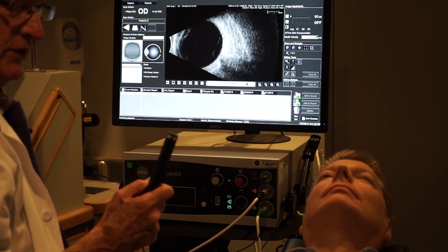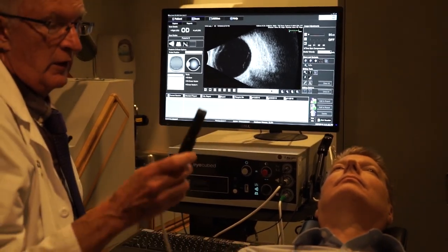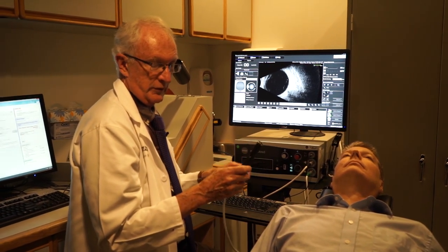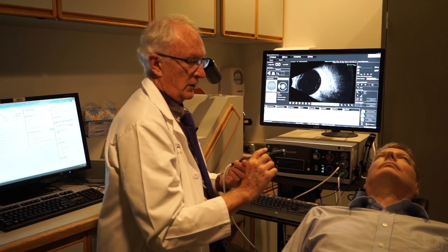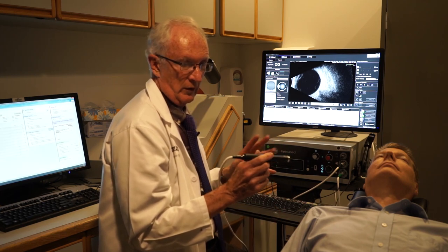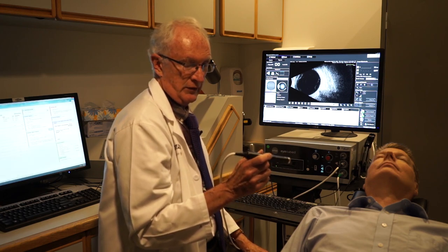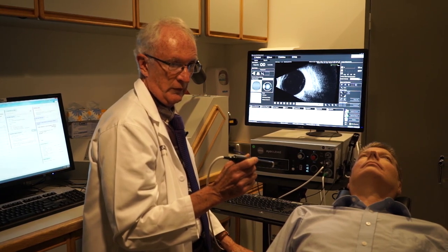That's the basic B-scan examination: using a 10 megahertz probe, going around the eye in six positions both transversely — parallel to the limbus — and longitudinally — perpendicular to the limbus. By doing that we see everything all the way to the pars plana. What we don't see is the ciliary body and the space behind the iris; that's where the immersion technique comes in, which I'll demonstrate in a few minutes.